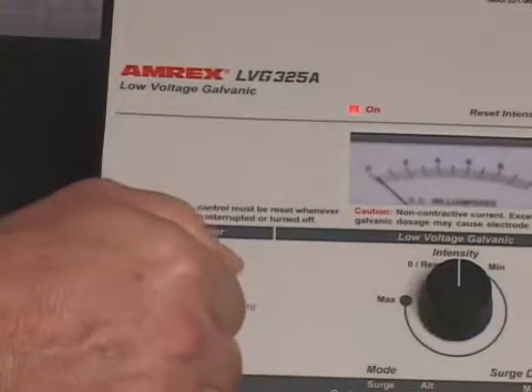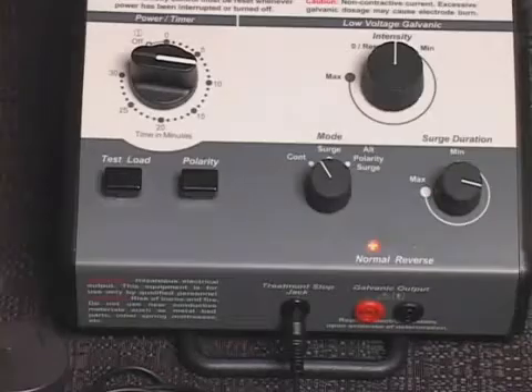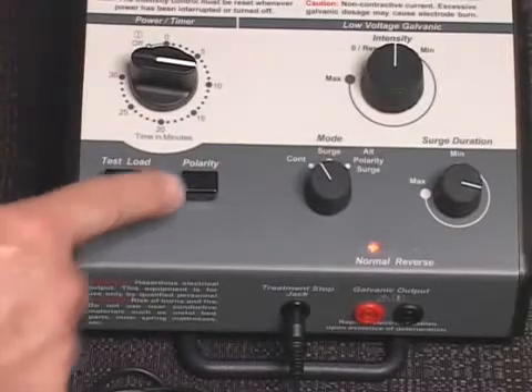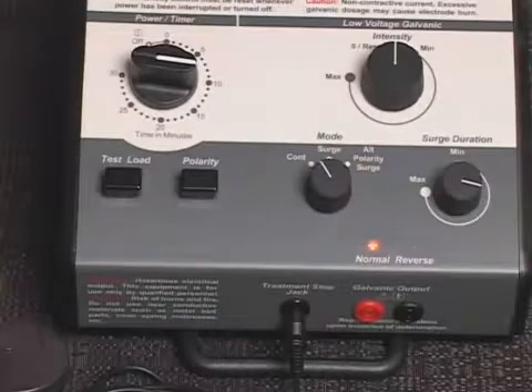Rotate the power timer knob and set it to the desired treatment duration. The on indicator light located above the upper left corner of the low voltage galvanic meter will illuminate, and the normal polarity indicator light will illuminate. Depress the low voltage galvanic polarity switch to select normal or reverse polarity. The normal or reverse polarity indicator light will reflect the selection.